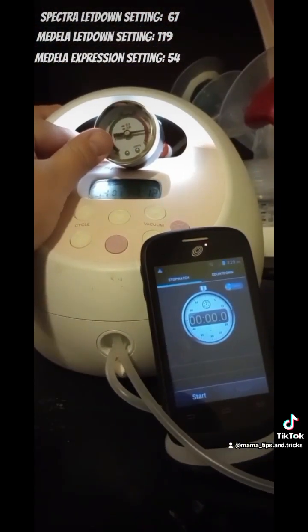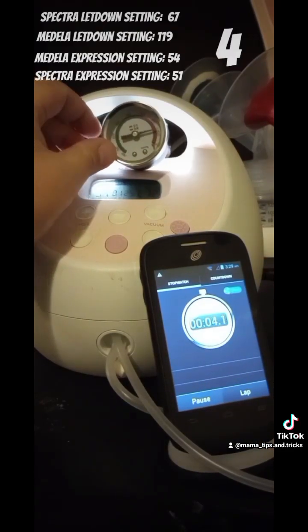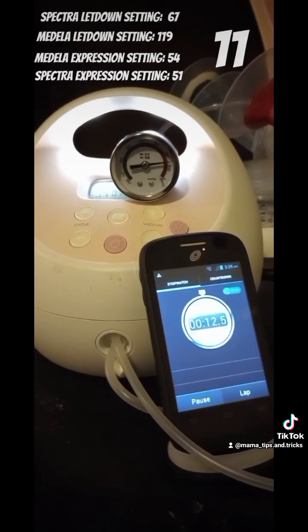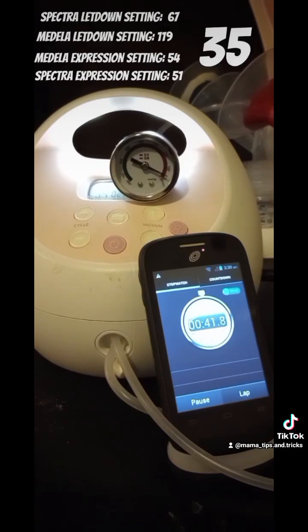In comparison, Spectra normally lasts about 1,500 hours, which is about 6 months of exclusively pumping, and then Medela lasts a lot shorter of a time before it needs to be taken apart and cleaned or replaced. And that's a good month or two for the Medela, and it's a good 6 months for Spectra if you're exclusively pumping. So like I've said time and time again, people respond differently to different pumps.